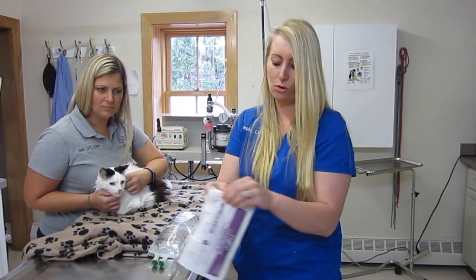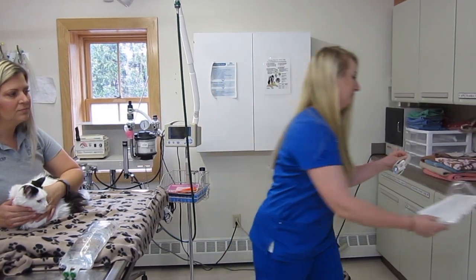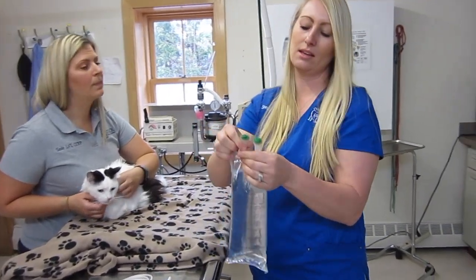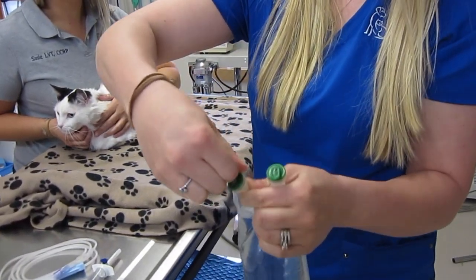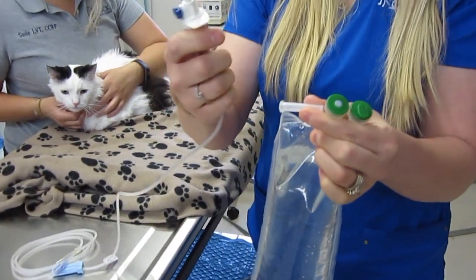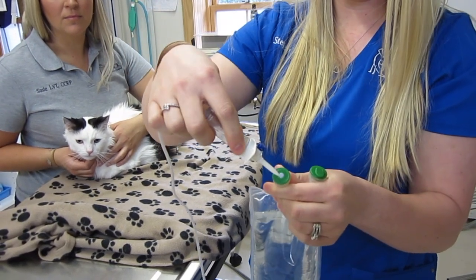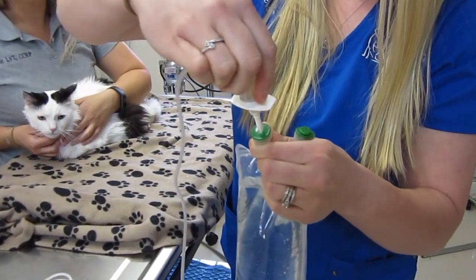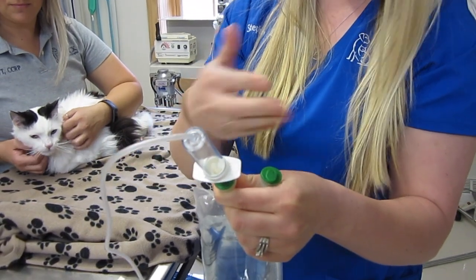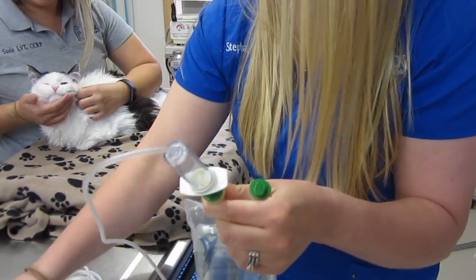The next thing you want to do is open your fluid line. And what you're going to do is pop off one of the bottom areas here, and you're going to uncap what we call the spike. And what's going to happen is the spike is going to go directly into the rubber end here. And again, not all fluid bags will have these caps on them, so you'll just have to see, as long as it has a rubber area, that's where you would insert the spike.